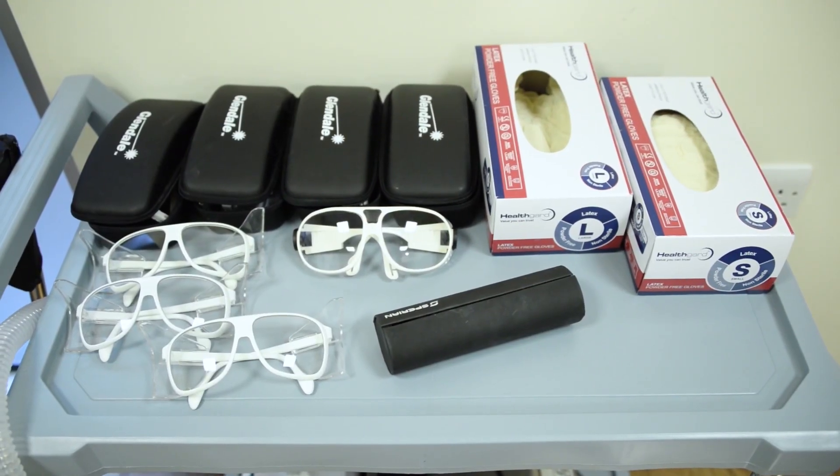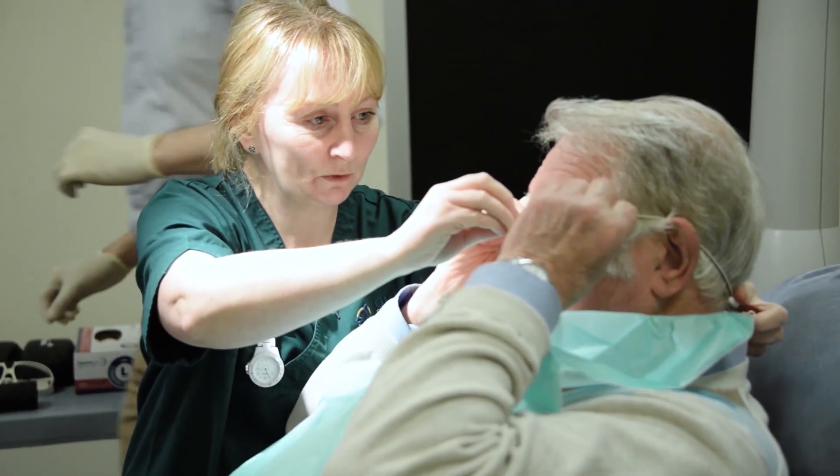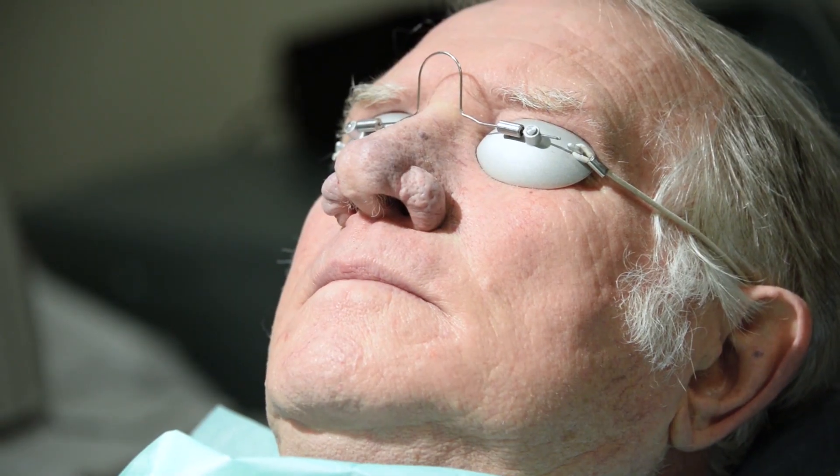Clinic doors are locked, and necessary laser safety measures are undertaken, including eye protection for staff and the patient prior to the commencement of the laser treatment.